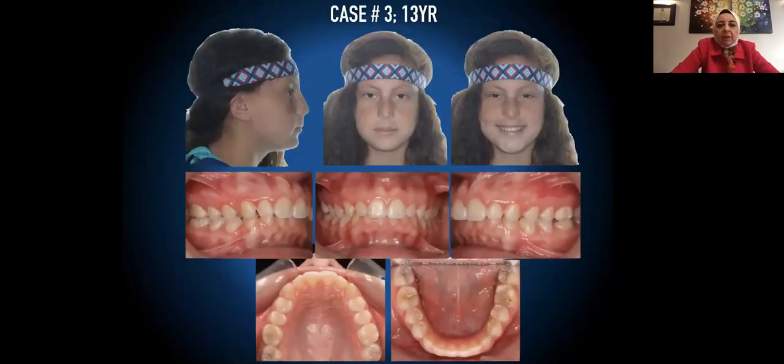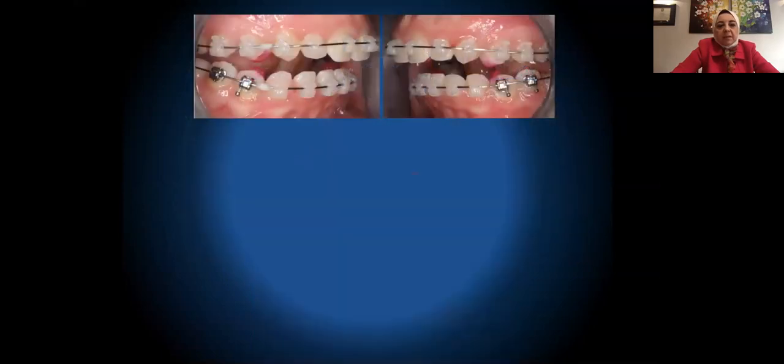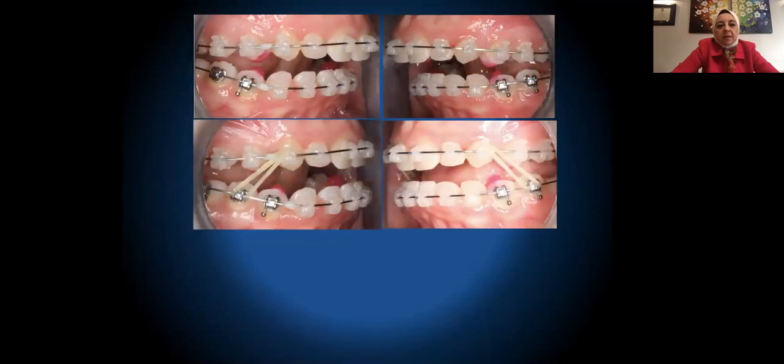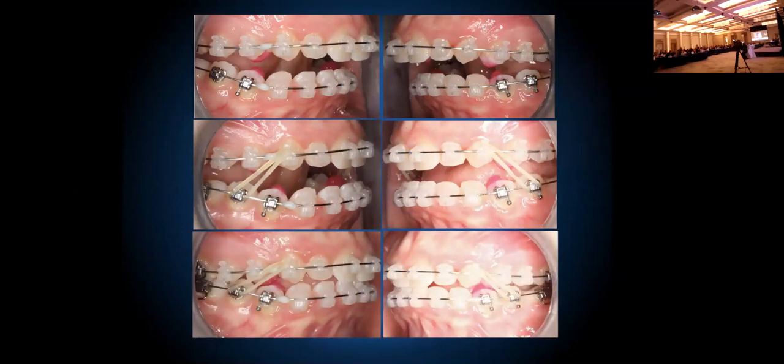Case number three: again a Class 2 case with the DBIBR in place with elastics.